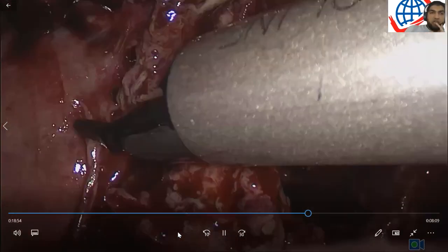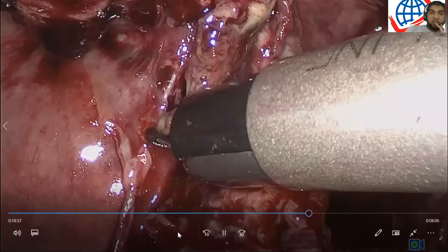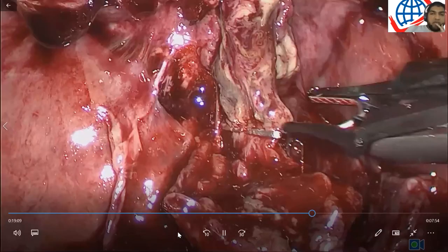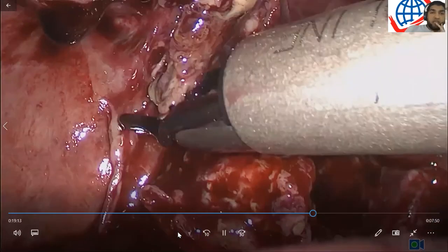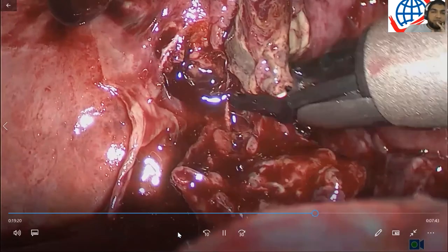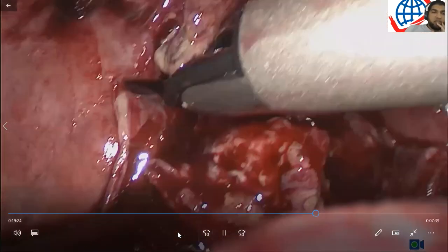When you're applying your clips, also make sure it comes in under vision. We can see the other side of the instrument quite nicely. And when you see the other side of the instrument, you can then, with a clear mind, apply your clips. Sometimes in a very friable duct, if you apply too much traction, the duct can tear. So just be gentle and secure the duct as best as possible. And your artery. Whenever you're applying your clips, make sure you see the other side.